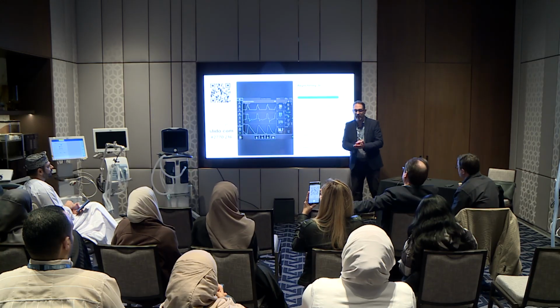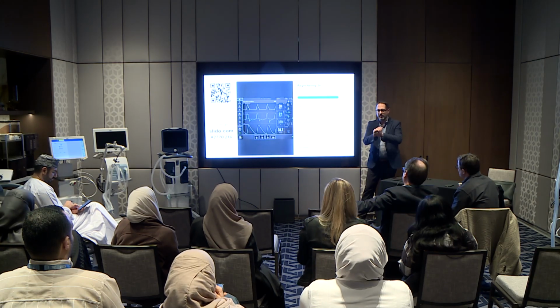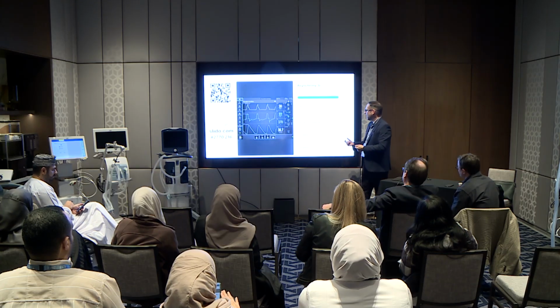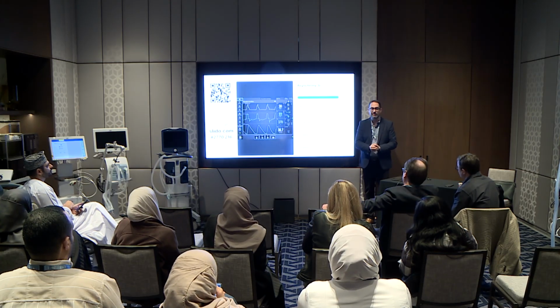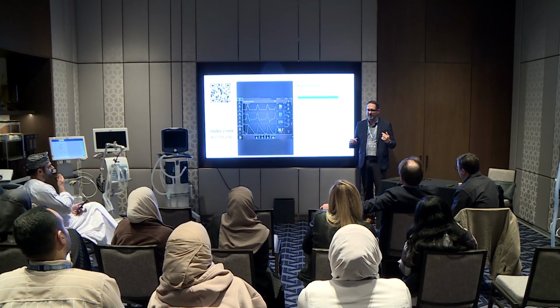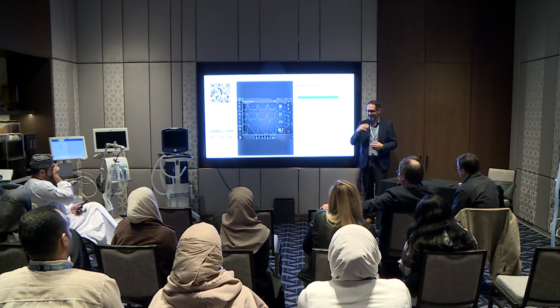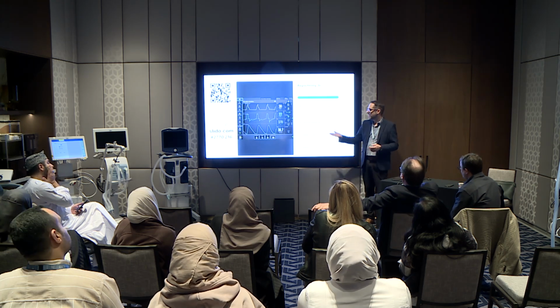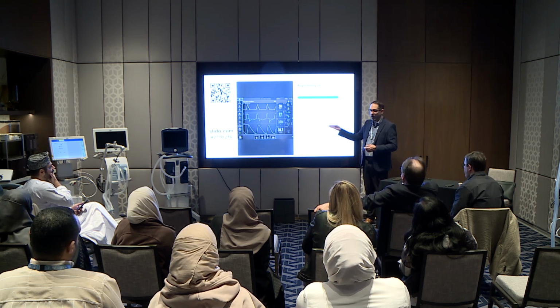Decreased sedation was the highest choice, and I agree with you. Again, now what if your patient already had the decrease in sedation? Switch to pressure support ventilation, very good. The patient is either going to take over breathing, or they might breathe but not sufficiently enough to maintain gas exchange. They might hypoventilate, their rate might be 8, but you can either do that. You can also do this.